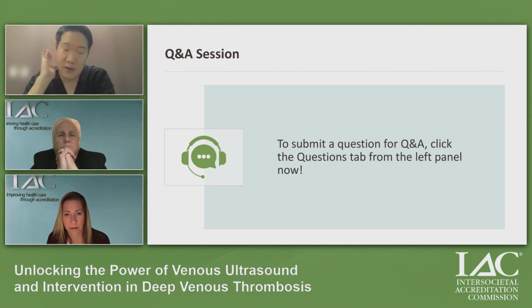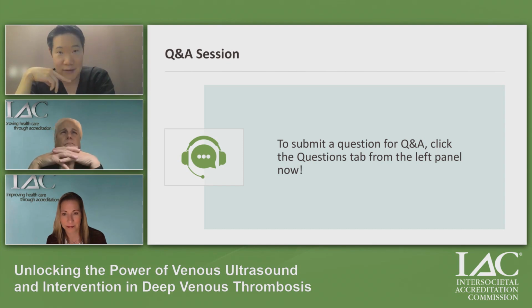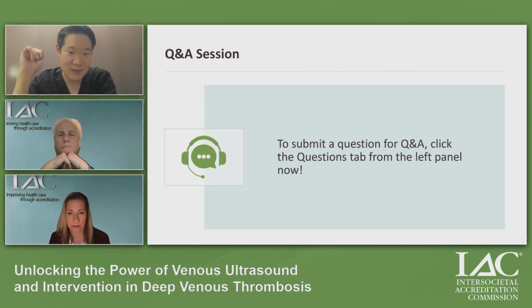I think that even though I said there's a less clear treatment paradigm for that, we do have some clarity, but it's not like there's a checklist you can go down and say, okay, this because of this, it's this. I think it's a bit of a custom job with the calf veins. I think it's important to look at the calf veins because first off, if you do it, you get better at it. It's not the easiest veins to look at. I know that because I do interventions down there, and it's not that easy compared to a common femoral or femoral vein. And so even if you scan and it's negative, every time you do it, you're getting better.